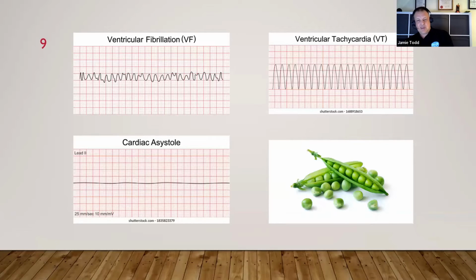So by putting in a slide or a book that contains one rhythm with a picture that says PEA, that creates a mindset that that's what PEA looks like, and that might be a problem in itself. So there are problems with the recognition of all these rhythms, as we're going to talk about now.